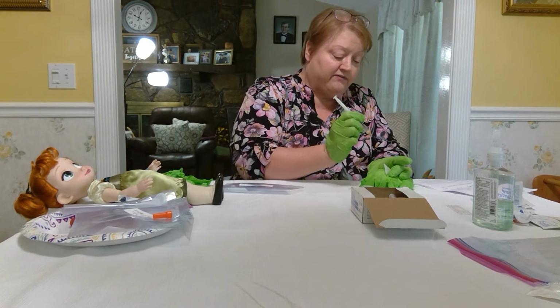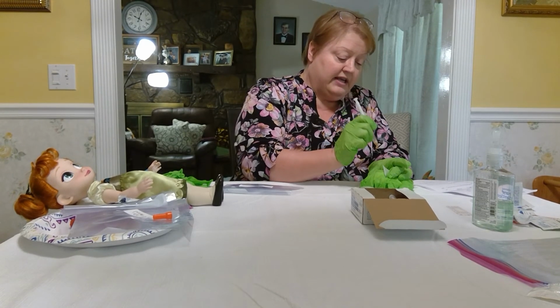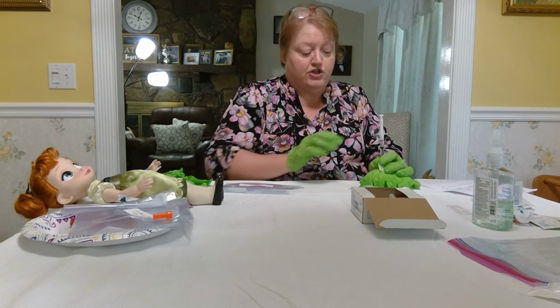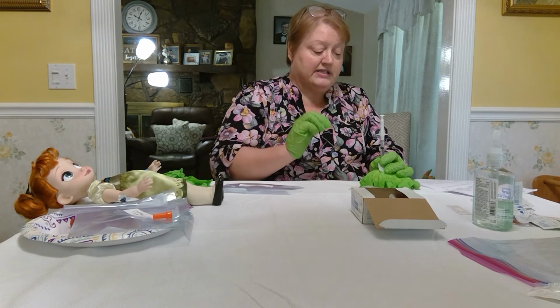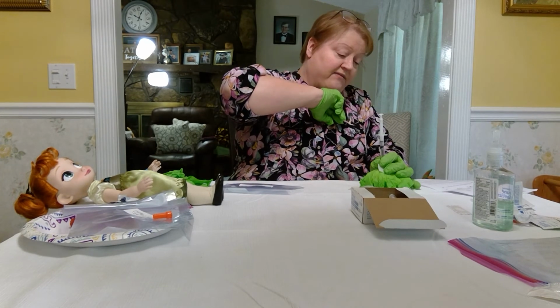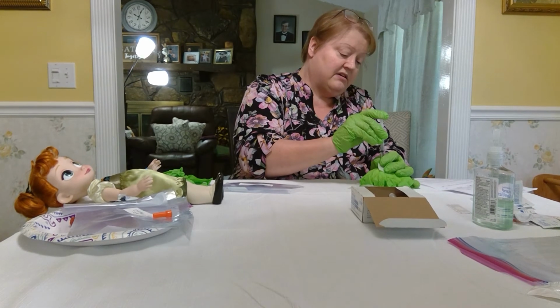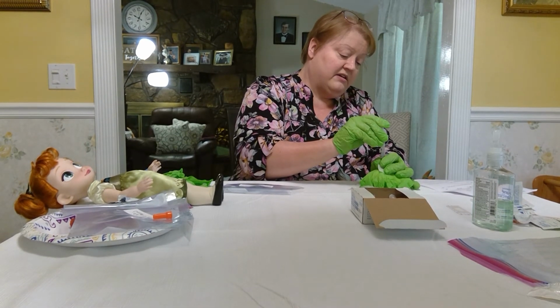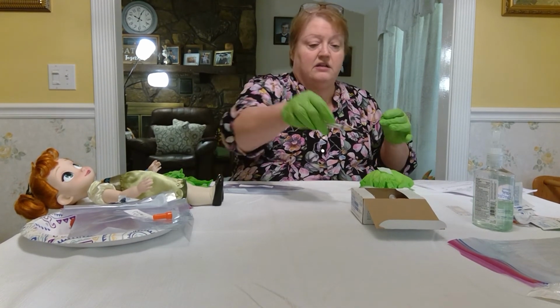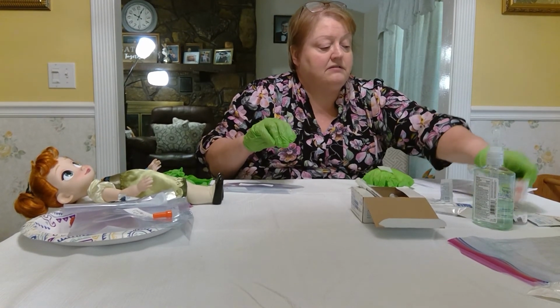I'm going to find my landmark. It's going to be in a dart-like fashion at a 90-degree angle into the skin. Anchor it by holding it. You want to make sure that you do not let that tilt because that would hurt the patient. And you must aspirate. Pull up to see if you have any blood. If none is seen, then you can inject. Once you inject, activate your needle, discard of it, and apply a Band-Aid to the area.